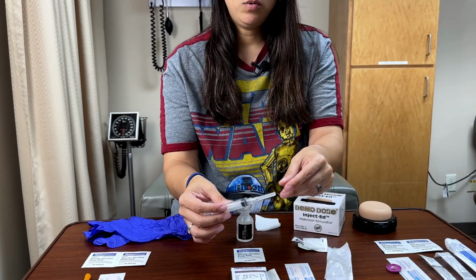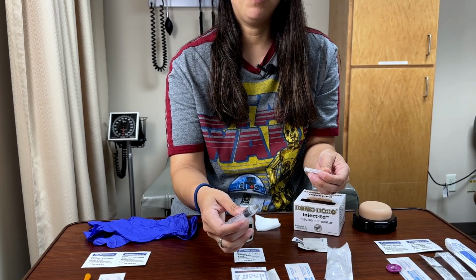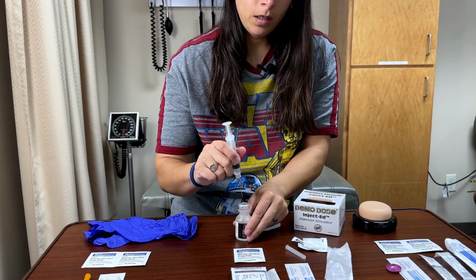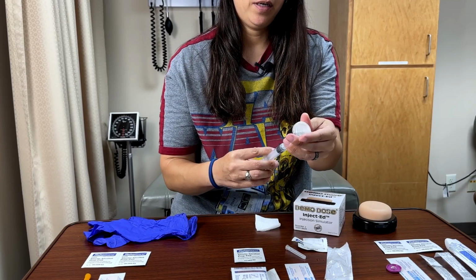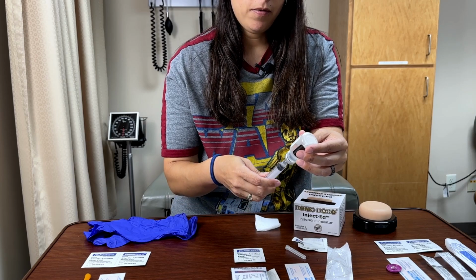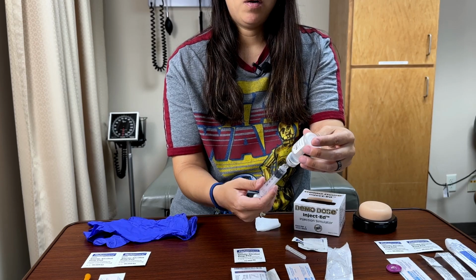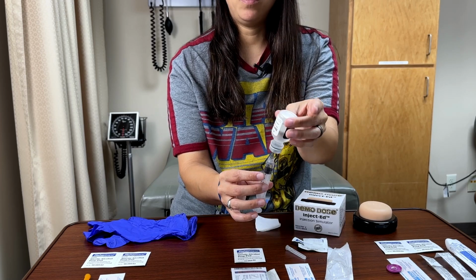Once we're done with that, we want to withdraw the amount of air that we need to inject the medication. If I'm going to put 1 cc of medication, I'm going to withdraw 1 cc of air into my syringe. Once I do that, I'm going to insert the needle into my medication and inject the air into the medication. Then I'm going to make sure that my needle is within the solution, and I'm going to withdraw my 1 cc. What we did when we put the air in there is create a vacuum effect, so the medication kind of automatically went in there.